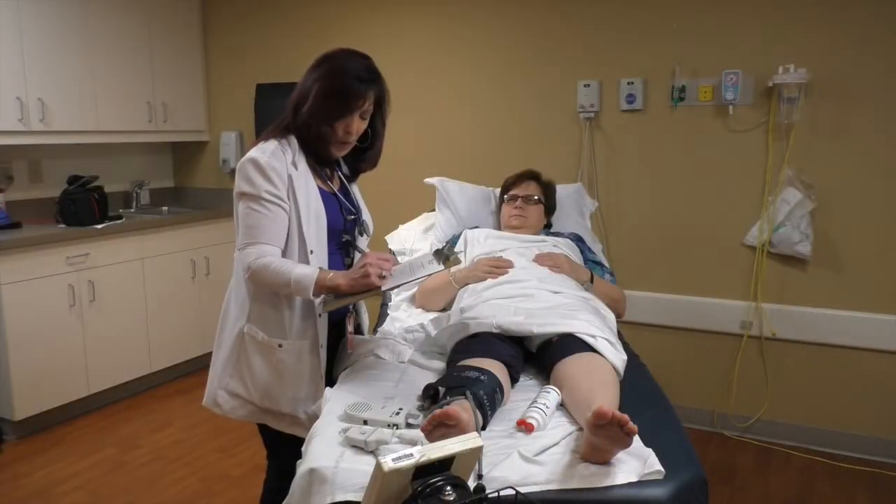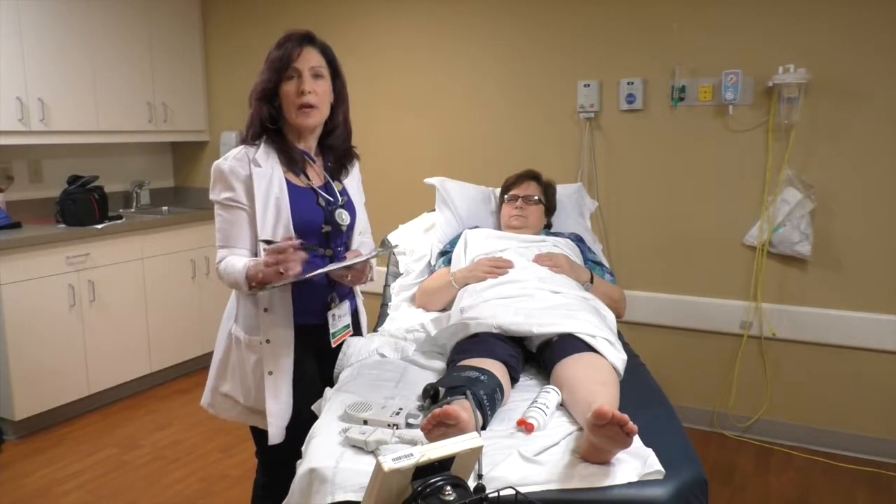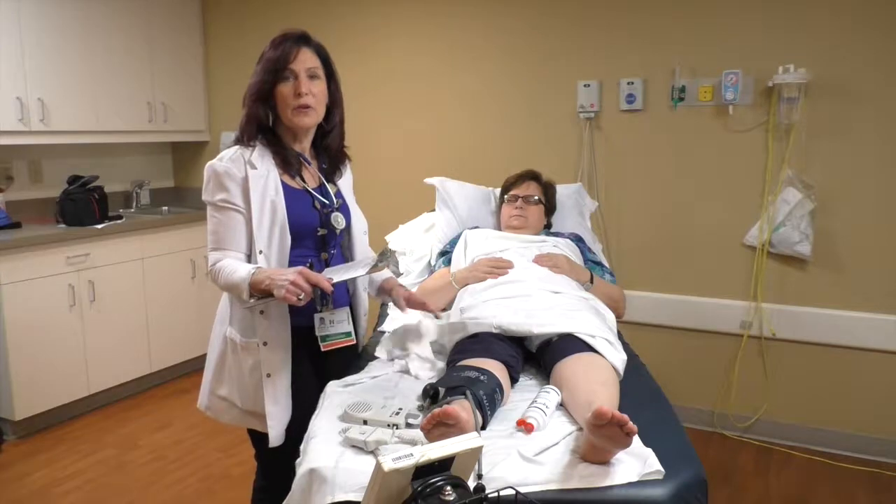So now we will calculate those measurements out and that's how you get your ABI value. The results are immediately given after the test and you would give those to your doctor. We would also send a copy of your results to the primary care physician.